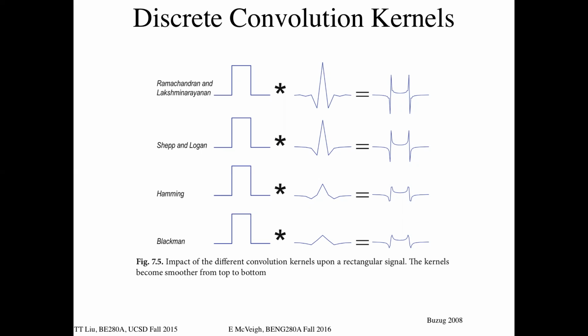When you look at the analytical function for back projection, this convolution is absolutely required to get the function right, so that the right numbers are inverted. The accuracy of the data requires doing this convolution first.